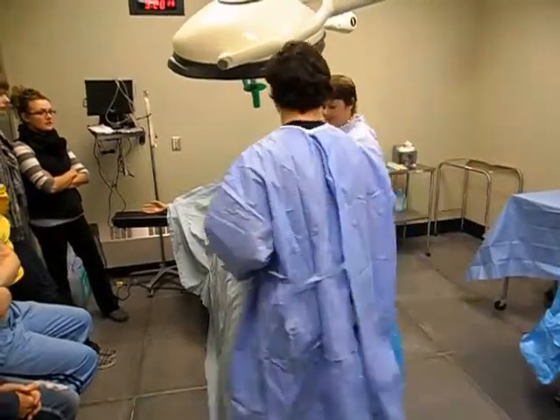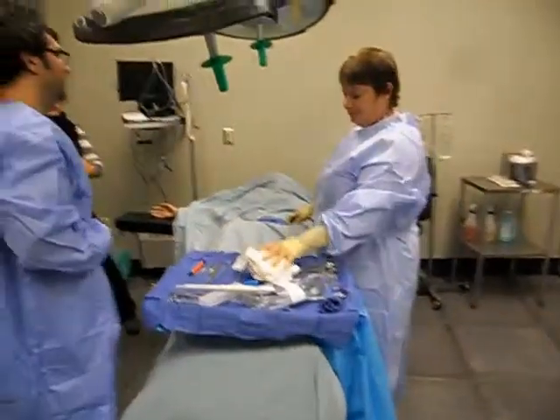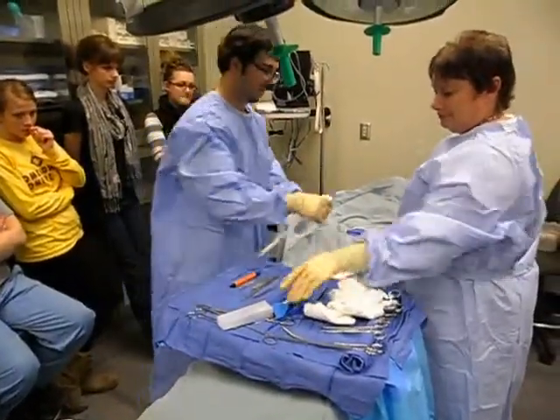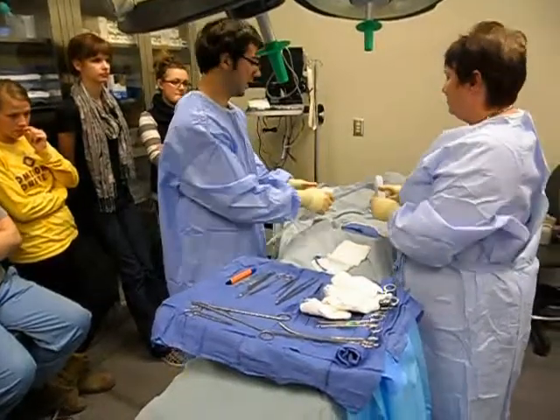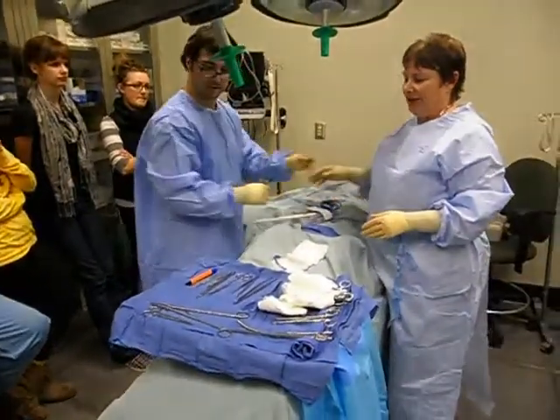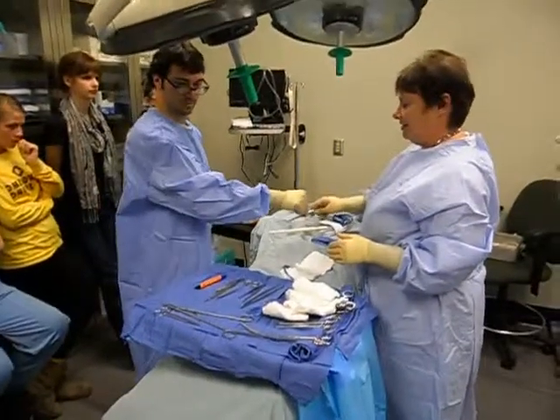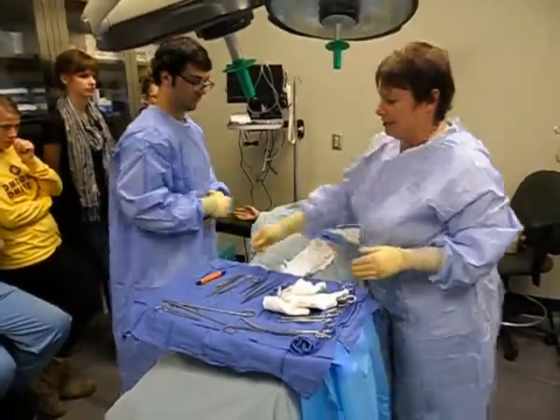And I have to look to see which side my cautery's on. And my suction, it looks like suction's over there. So, do you want me to actually break this? No, you don't have to. But then you're gonna throw this off, and then I'm right-handed, so hand the knife. Time out, and then this is when your time would stop.